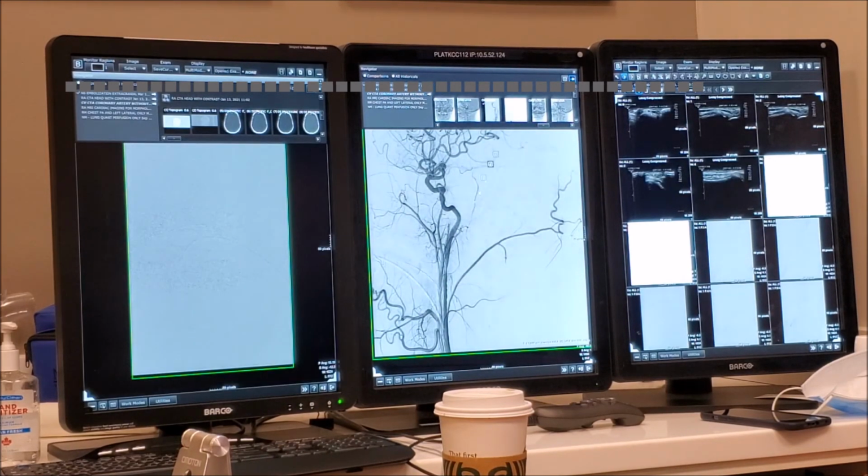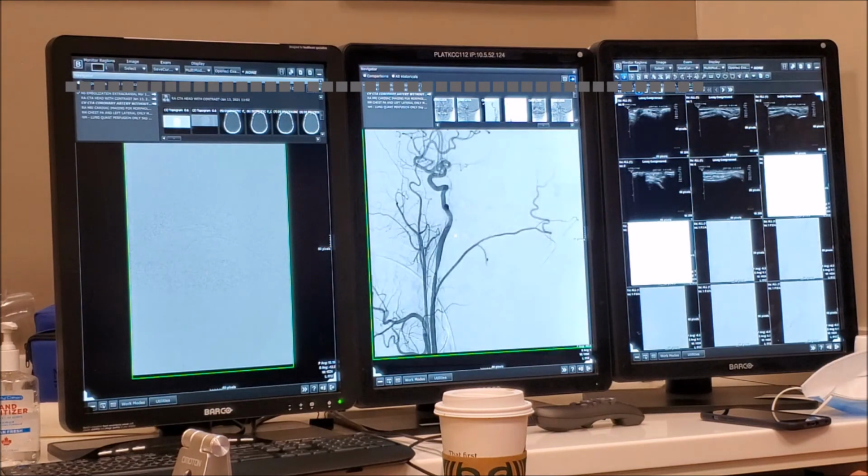So why do you repeat this one? It would be nice if you do selective injections. He wanted to get the ICA out of shadow. There's a midpoint stenosis, ICA. There's another thing. Can you, Christina, tell me this branch? What is it?